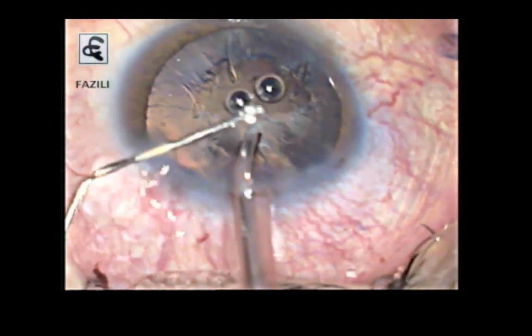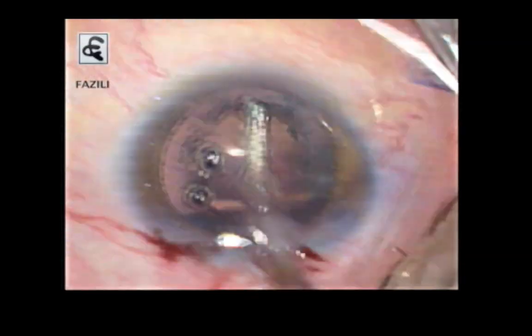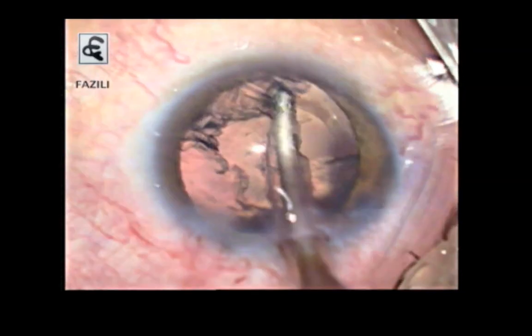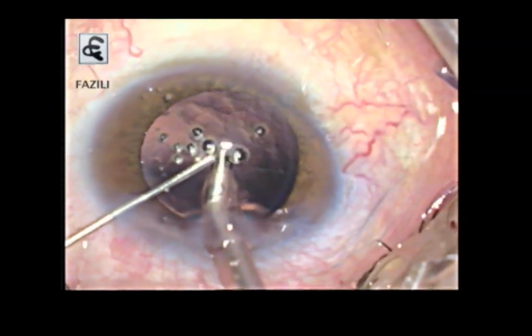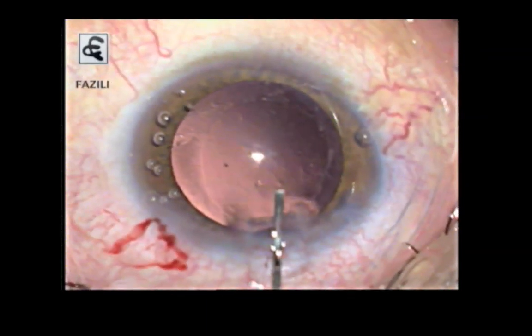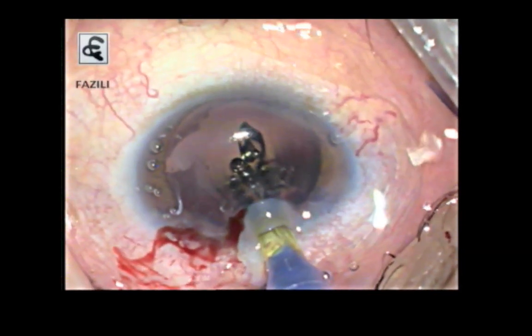You can see before I take out the phaco probe, I'm injecting viscoelastic from the side port. Now, then you are coming out. What that allows is that the anterior chamber fluctuation does not happen, and you proceed without much change in the anterior chamber depth. Again, before I'm taking out the IA probe, you can see I am inflating the chamber again and then coming out. Sometimes there is a difficulty injecting the viscoelastic, but if you stop the irrigation and then inflate, it becomes much easier.